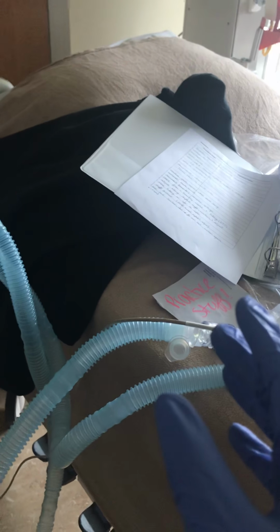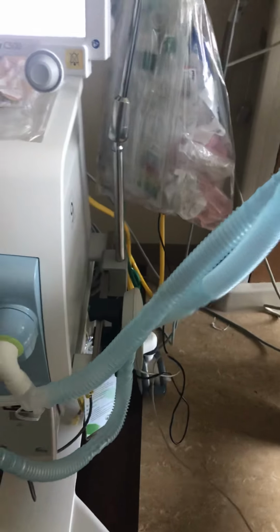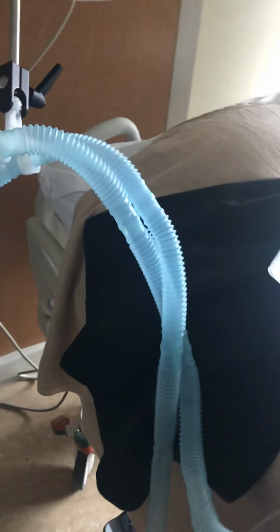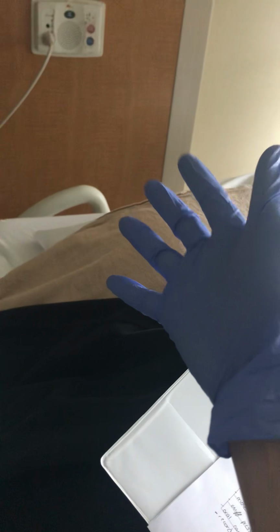So we have our vent setup all complete. We have our documentation. Patient assessment would include making sure there are no kinks in the hose. The hose is at the bedside, kind of level with the patient. We want to check their ET tube. Did it get pulled out? Did it get pushed in? We just want to adjust that accordingly. Maybe move it from side to side of the mouth while we're doing oral care, just to relieve the pressure so we're not creating any sores or redness.